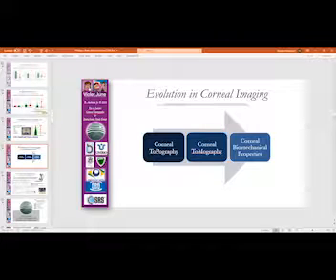So did I answer your question about the BAD display? The future is really hard to understand, what's going to be the real future of the display, but the future of the understanding is a multimodal idea. We go to the multimodality, which is understanding the cornea and the eye in a better way. We have segmental tomography with epithelial thickness.